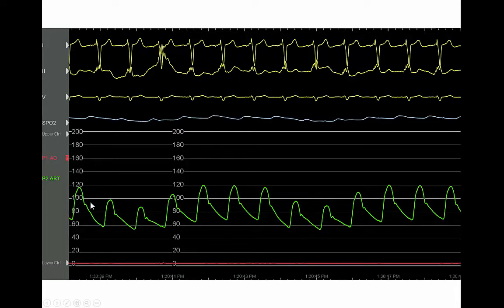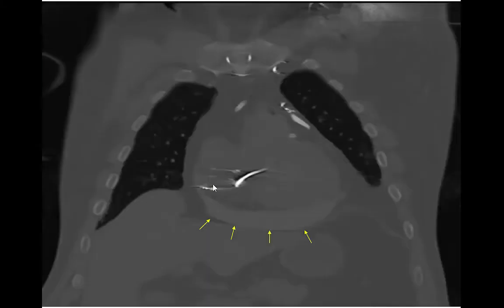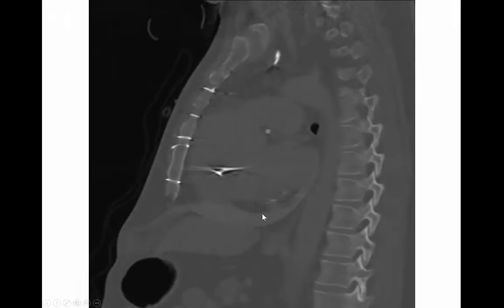At the end of the procedure, the patient had significant pulsus paradoxus; however, he was hemodynamically stable without chest discomfort, and echo contrast confirmed no ongoing bleeding into the pericardium. We performed a CT scan to assess the bleeding, which demonstrated a pericardial effusion that was loculated on the inferior part of the pericardium — likely explaining why we could not access it from the subcostal approach, as it was more inferior and posterior.